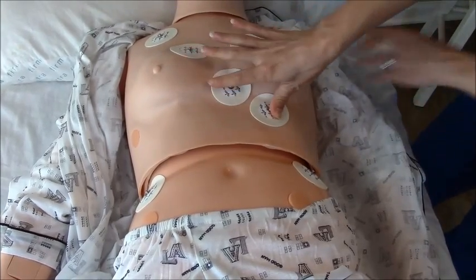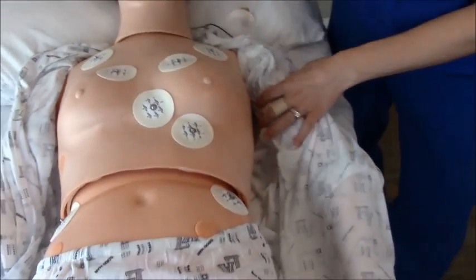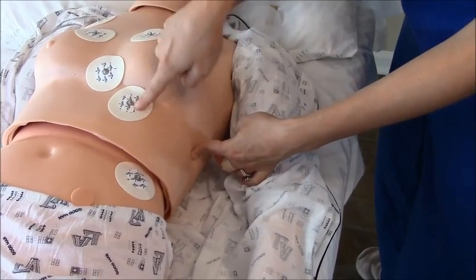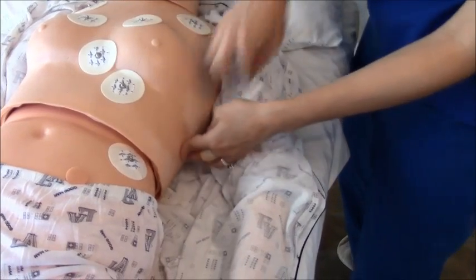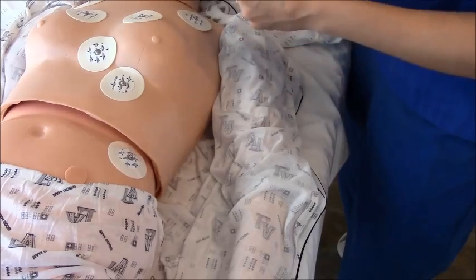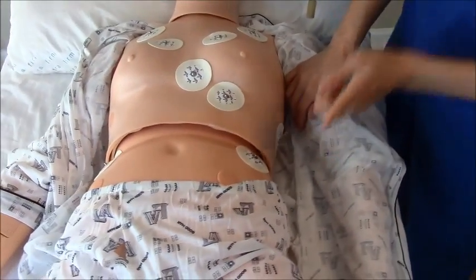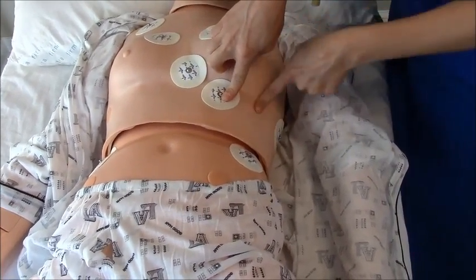Now we skip to V6. To find V6, go mid-axillary, underneath the armpit, down to the fifth intercostal space, which should be horizontally lined up with V4. Then V5 is placed right in between V4 and V6.